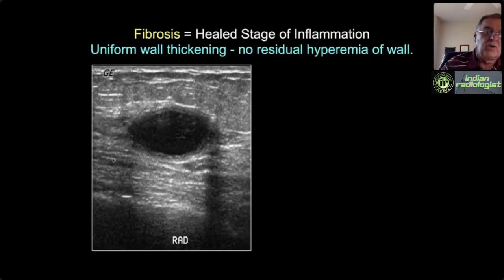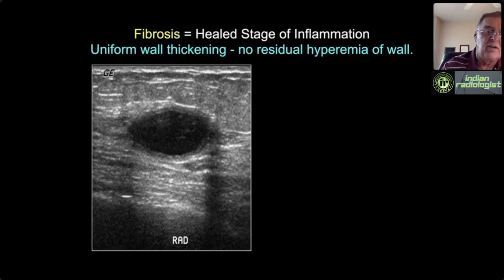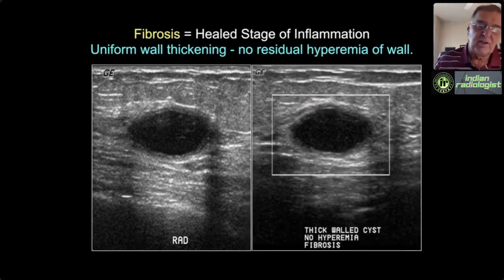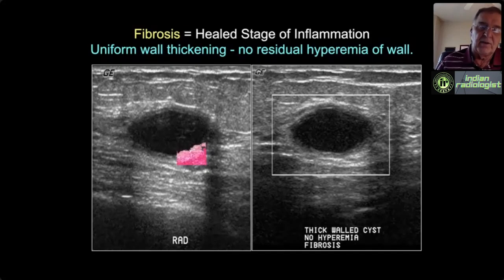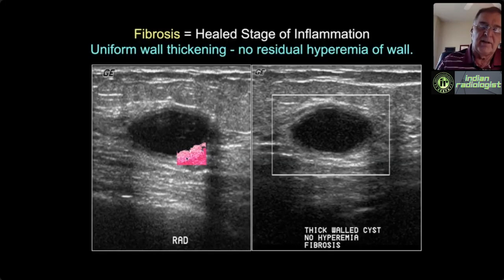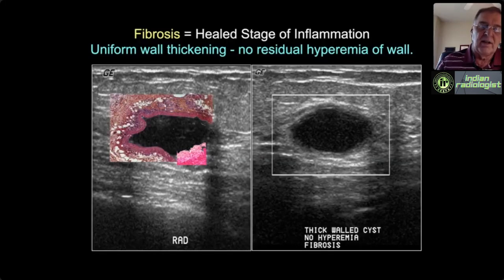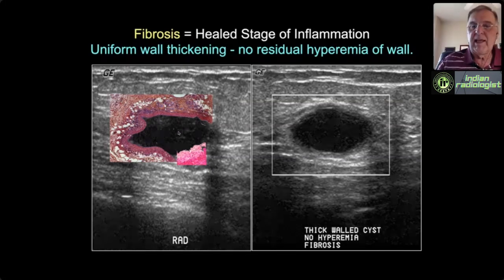Sometimes you'll get a cyst that's not acutely inflamed but has uniform isoechoic wall thickening—it's indistinguishable from an acutely inflamed cyst because it represents the healed phase. When an acutely inflamed cyst heals, it heals with fibrosis. When acutely inflamed, foamy macrophages or lymphocytes in the pericystic area create isoechoic wall thickening; when healed, it's fibrosis that creates it. These cysts won't be tender and won't have hyperemia when they're just thick-walled fibrotic cysts.